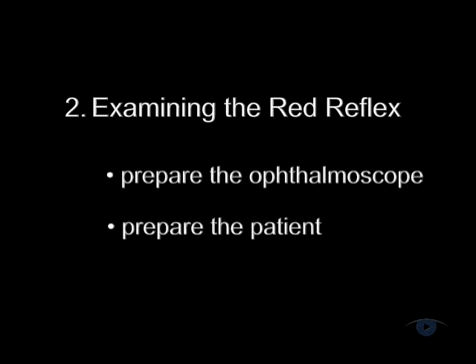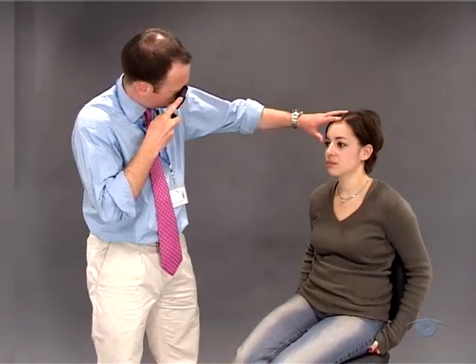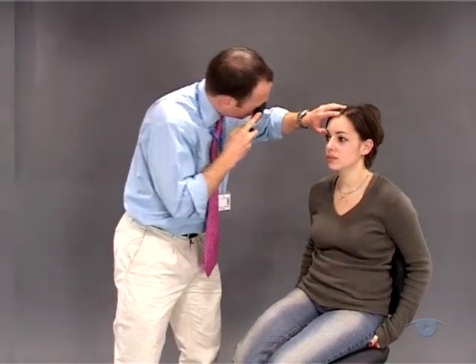With the ophthalmoscope and patient now prepared, you're set to proceed with ophthalmoscopy. To keep their eyes steady, you'll need to give them an object straight ahead that they can gaze at with one eye while you're examining the other. Use your right eye and right hand to examine the patient's right eye, and vice versa for the left eye. You can gently place your other hand on their brow — this helps you to steady yourself and also enables you to lift their upper lid when you need to.